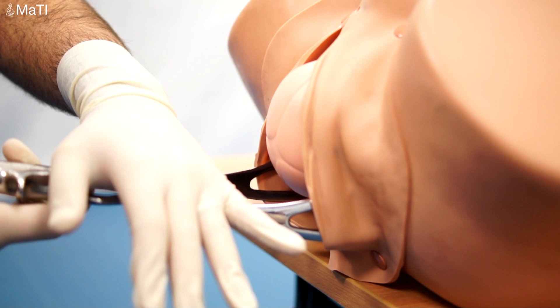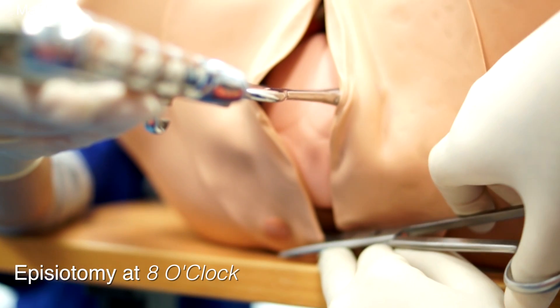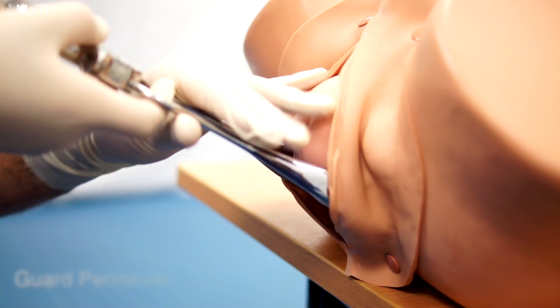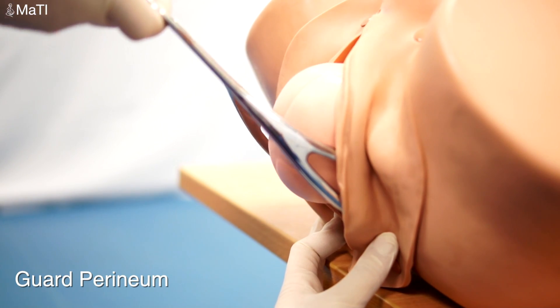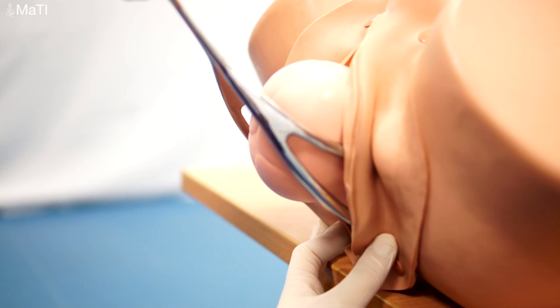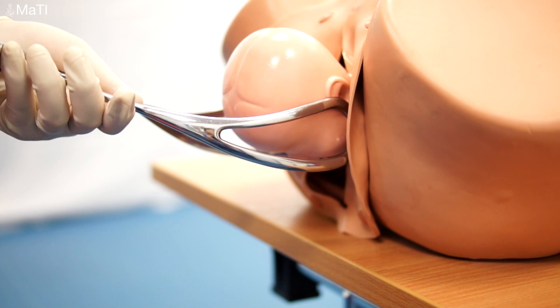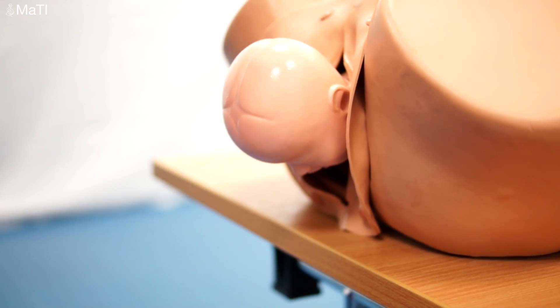Once the head is crowning, stop pulling horizontally and start pulling upwards. As the head comes forward, you can do an episiotomy at 8 o'clock — we no longer recommend an episiotomy at 45 degrees. Guard the perineum to ensure there's no extension of the episiotomy, and the baby is delivered. We remove the forceps as they were applied, and deliver the baby.